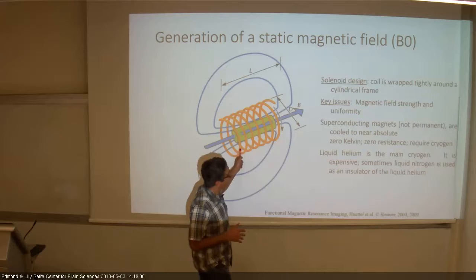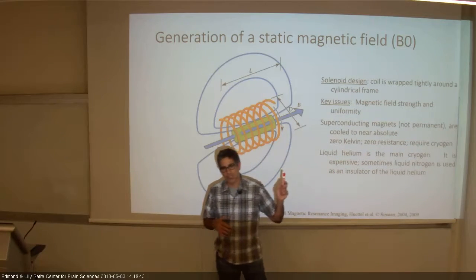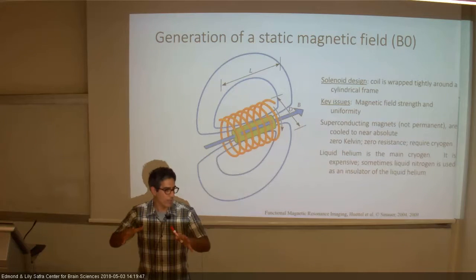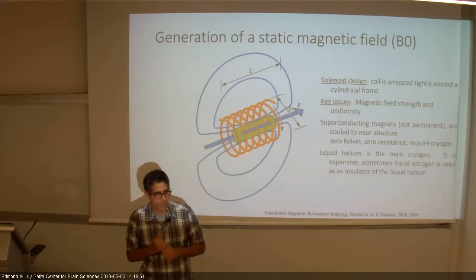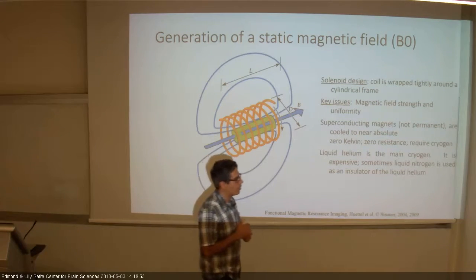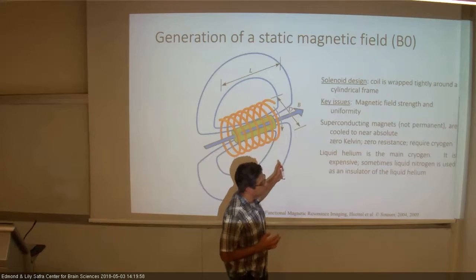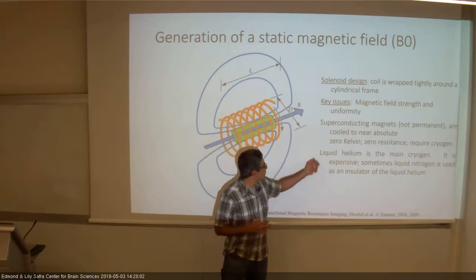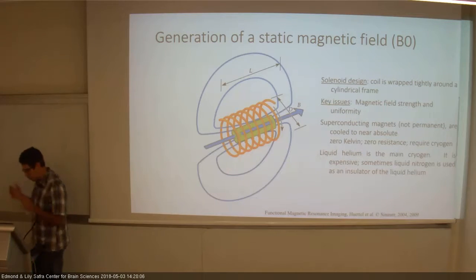And sometimes when these things actually, so that's another risk in MRI. If by any case this helium penetrates to the room, it will take all the oxygen out, and you can't stay without oxygen. And of course, that's another potential risk in MRI, much rarer than getting inside with metals, but that's part of the system. So it's really highly condensed liquid helium that we have there, and it should stay closed and safe.